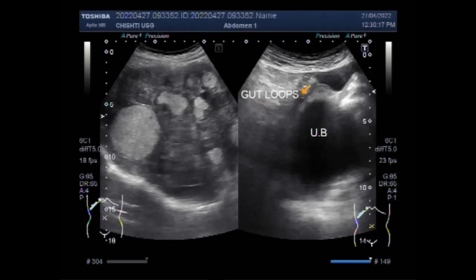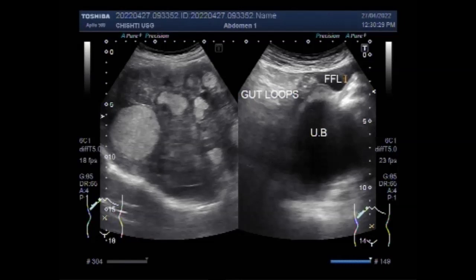Now you can see there is minimum ascites. The free fluid is seen in the lower abdominal cavity just above the urinary bladder.